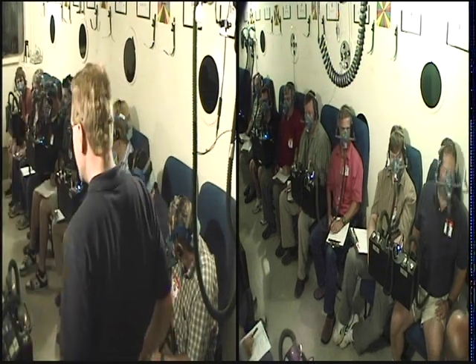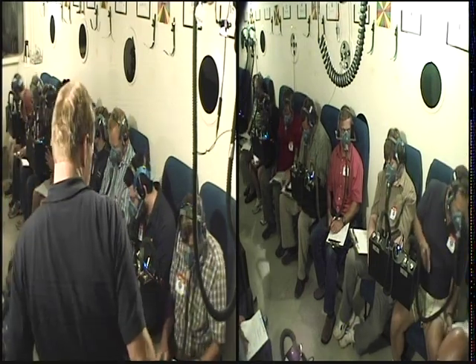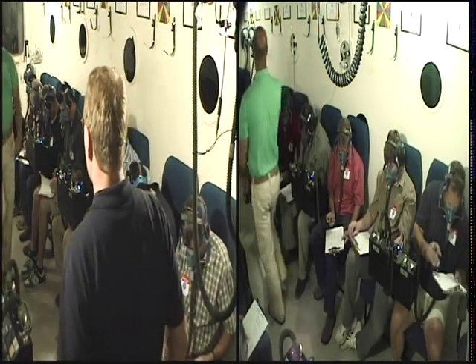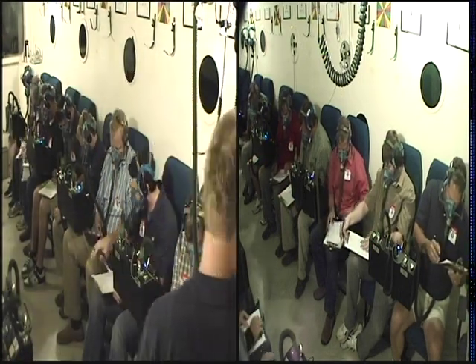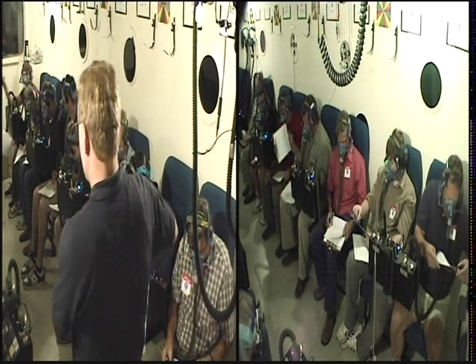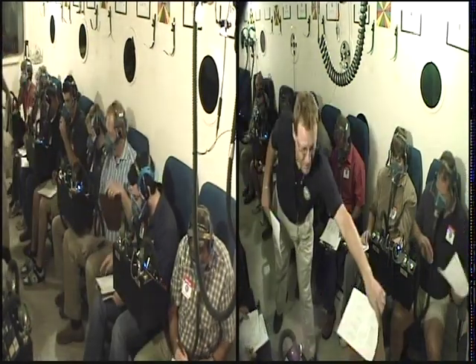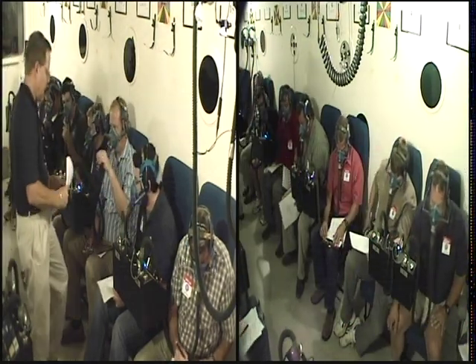Okay, very good. What I need you to do is, on that worksheet, circle the one symptom that stood out more than any other symptom. Take that worksheet off the clipboard and put the clipboards back where you found them. Make sure there is a worksheet left on there for the next person. If not, let Eric know. And then we're going to pass out an extra worksheet, but we'll also pass out a gauze pad that has alcohol on it so that you can clean your mask out. And once you've cleaned your mask, go ahead and hang those masks with the headsets. I'll come on the inside and I'll help.